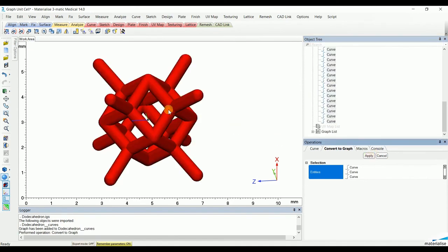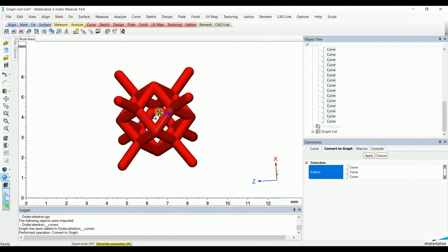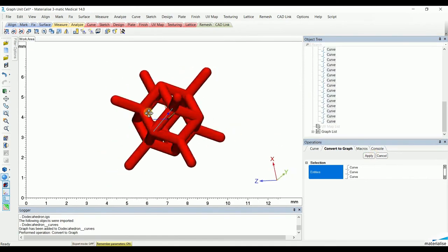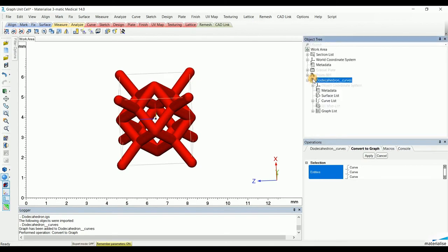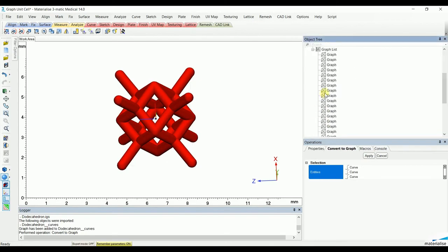Here you go. Once again, we will go to the graph list and merge all the different graphs into one unit cell.